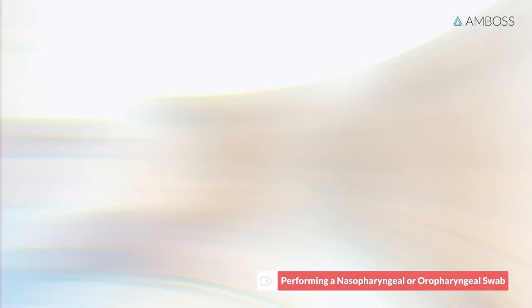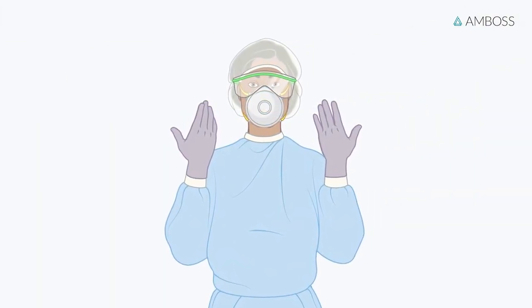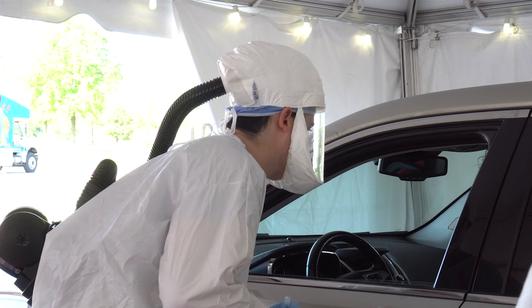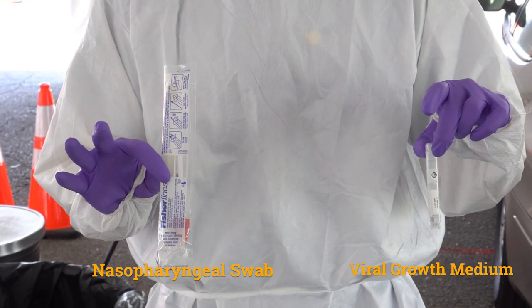Proper personal protection equipment must be worn prior to any patient contact. This helps to protect yourself and those around you. The patient's demographic information is confirmed and they are advised that they may experience brief discomfort or minor epistaxis during testing.